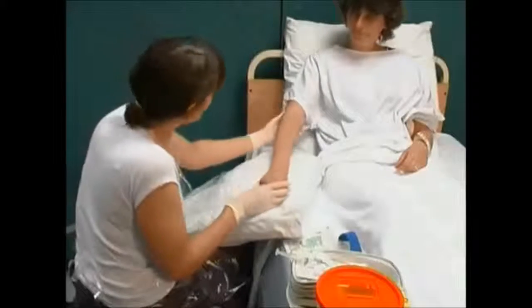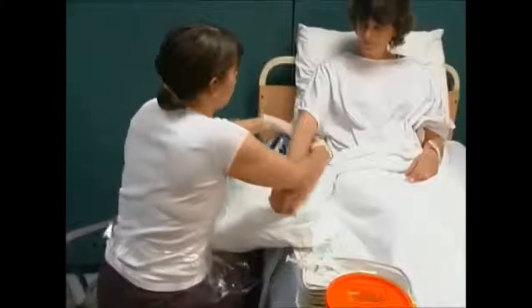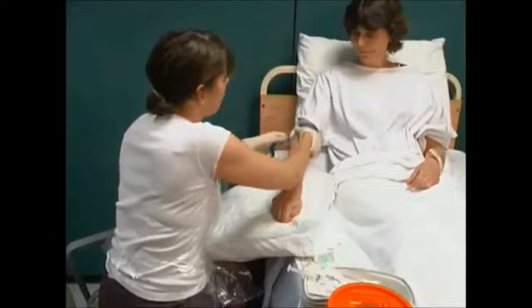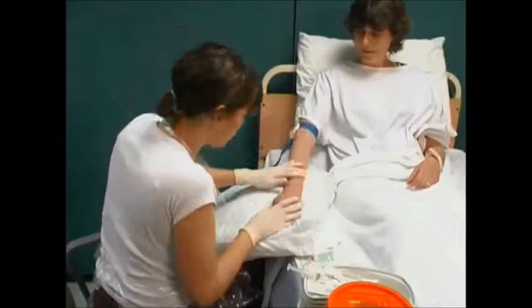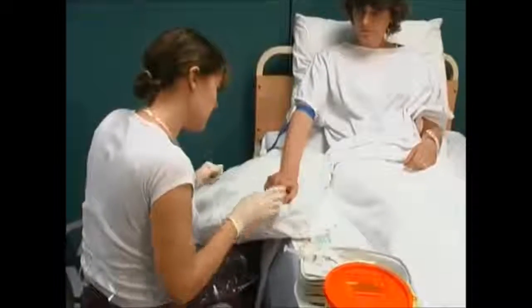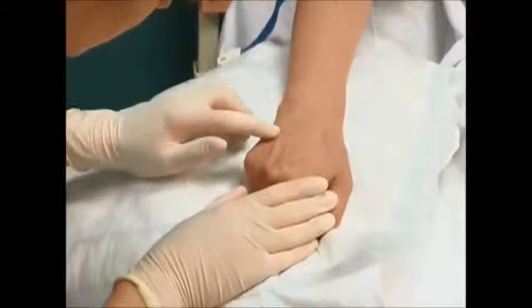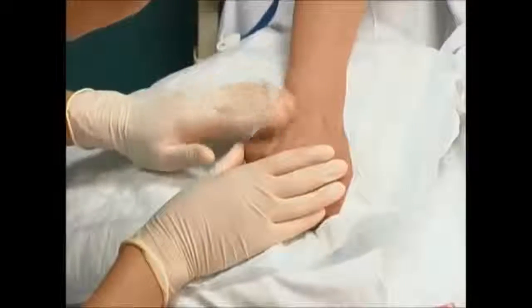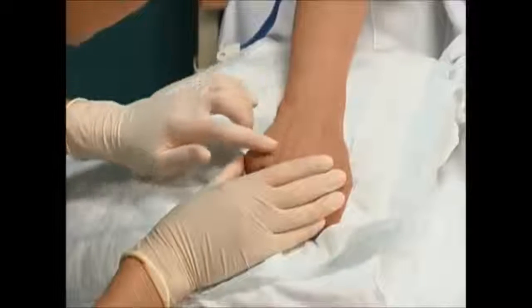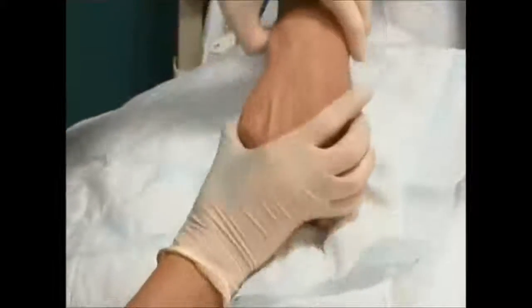Okay, just position your arm. I'm just going to put a tourniquet on, just to have a look and see what veins. Does that feel okay, not too tight? Yeah, that's fine. Okay, let's have a look. Just open and close your hand for me. Lovely, just relax your hand. I can see a nice one there. Feeling the depth. Just looking and feeling the vein. Okay, just relax your hand.